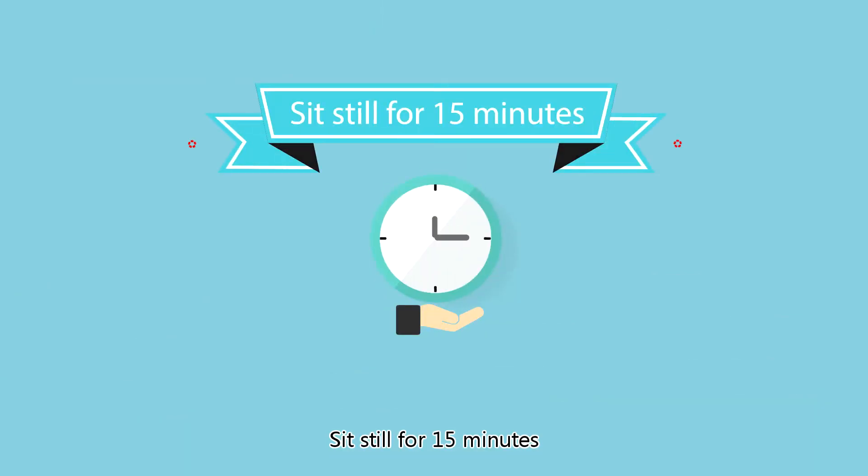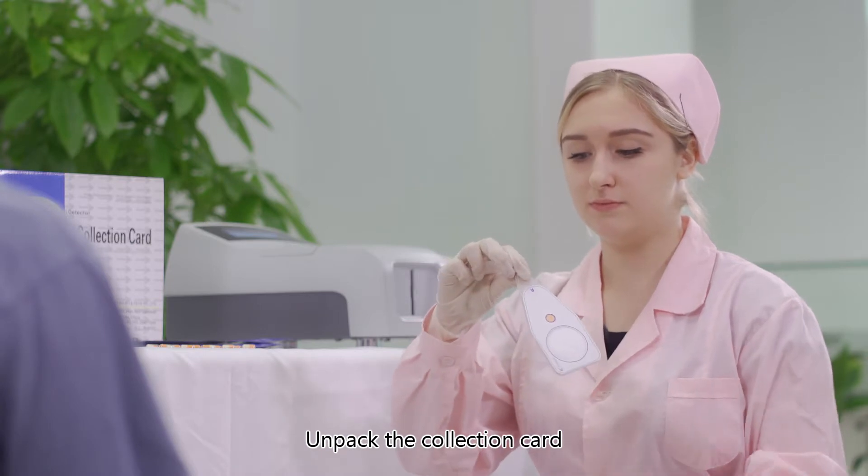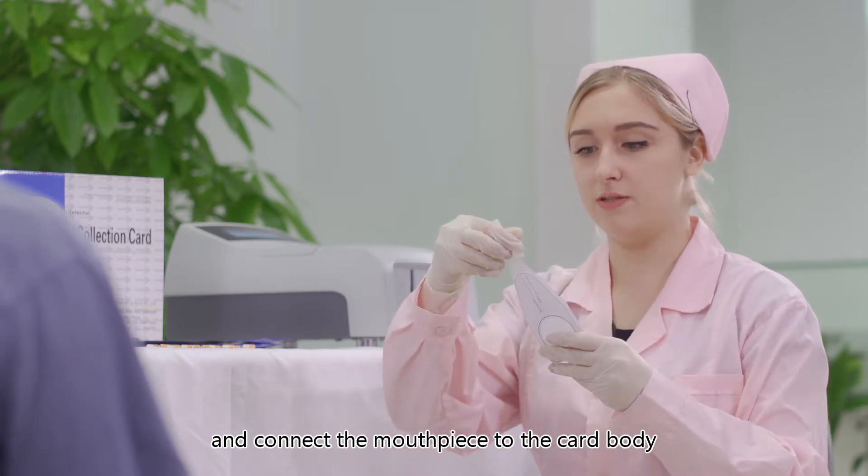Sit still for 15 minutes. Unpack the collection card and connect the mouthpiece to the card body.